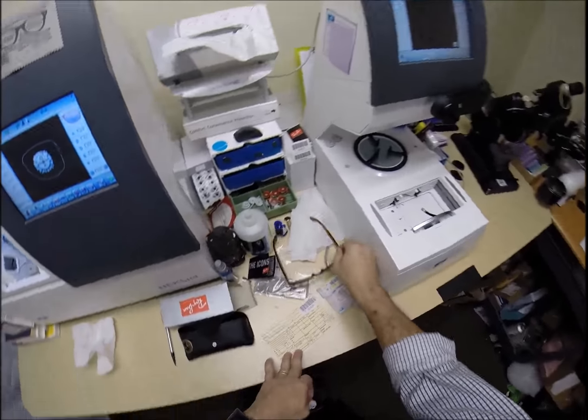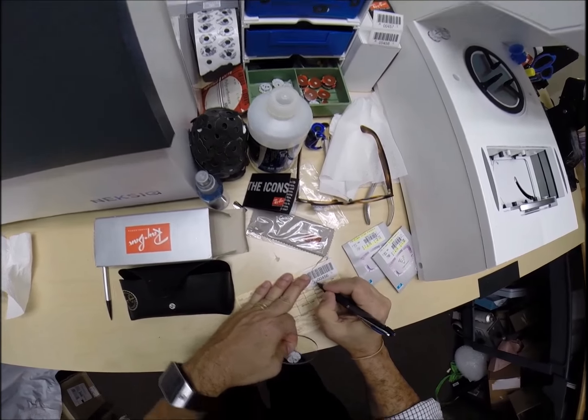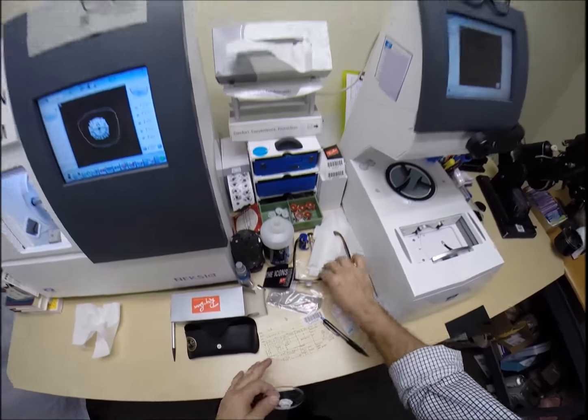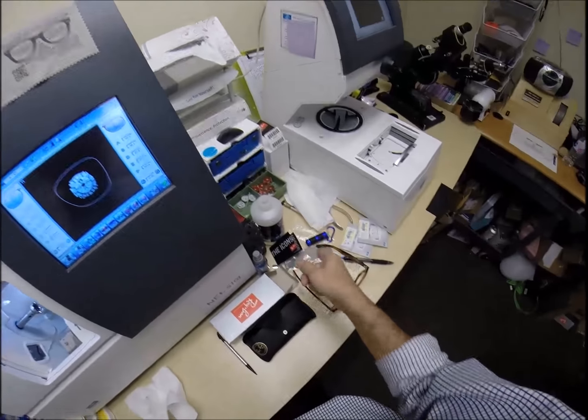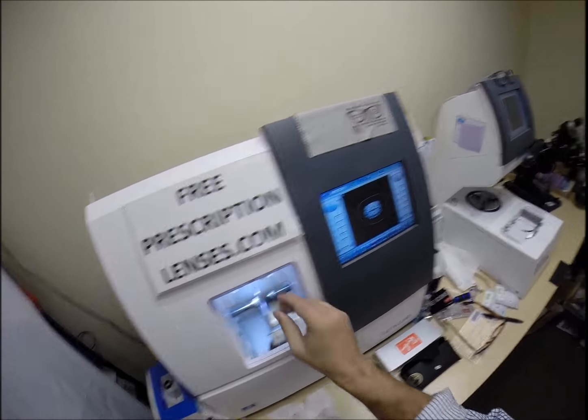So let's flip that over to L. Before I forget, I'm going to write -20 for the right lens. So if I ever send you lenses again, I know how far to take it down so that it mounts inside your frame perfectly and make a mess at the same time. I'm watching you, blue flashlight. So press that on there firmly, push that on there.